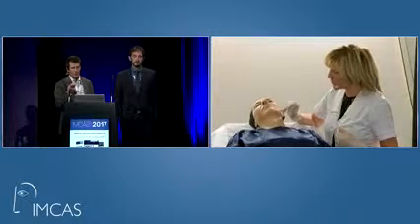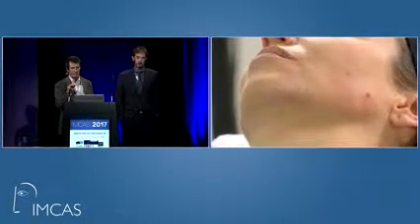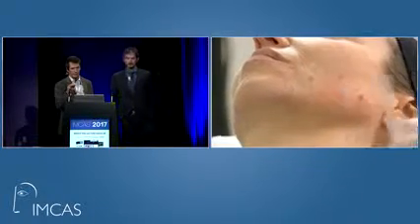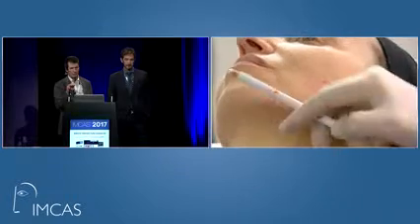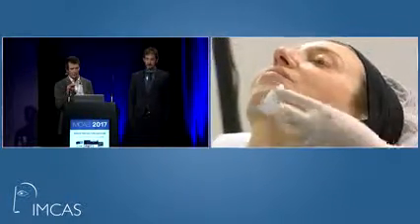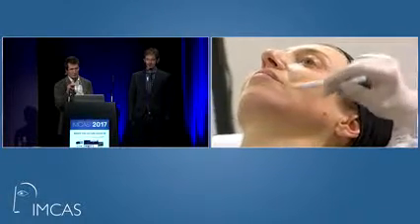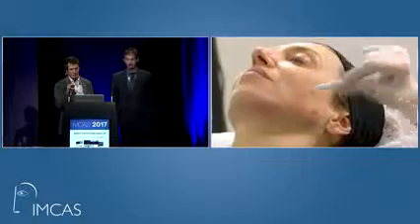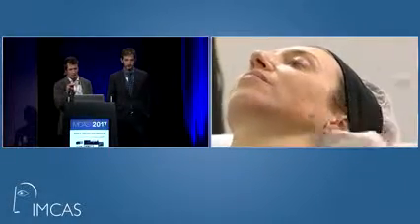I have injected in this notch, the mandibular ligament area, ultra deep too, just to harmonize the contour line. And I have injected superficially the fold, the marionette-line fold. Okay, so as I told you, Sandrine?